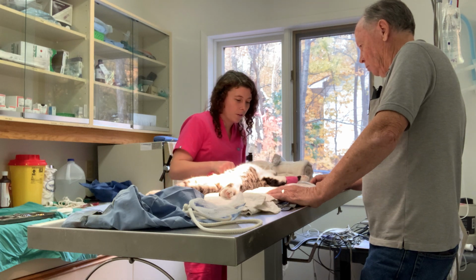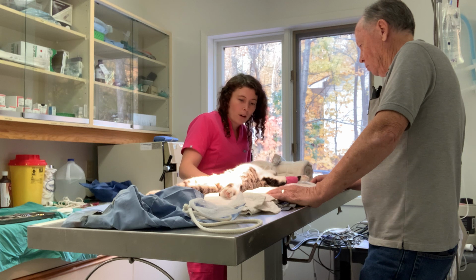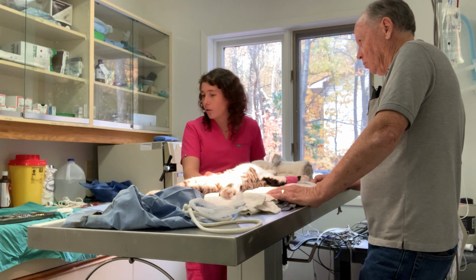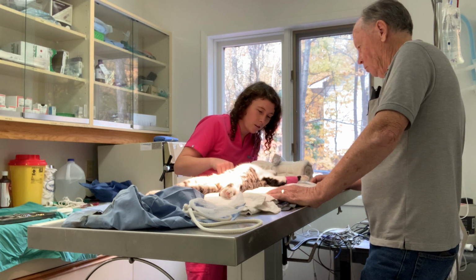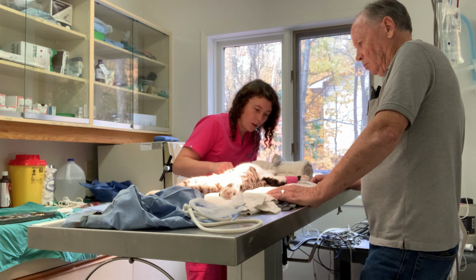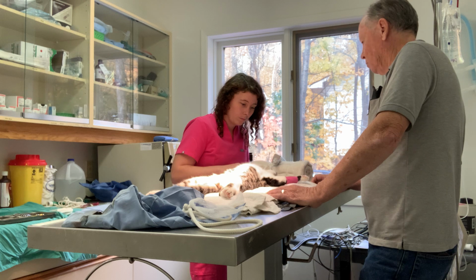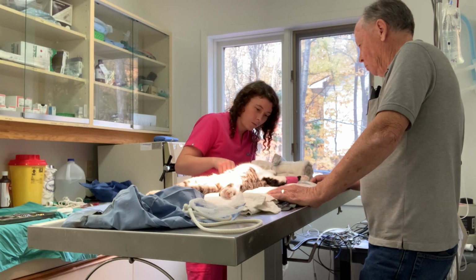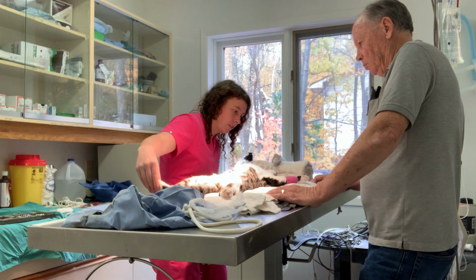Turn my Cardell off, it doesn't need to be on anymore. And we do have a lot of heat for this patient right now. The heat right now is from the heat blanket and this blanket on top here. So we've got a nice cozy area for our patient. And we're going to tuck our patient into some blankets once we go into the crate. Watching for those reflexes.